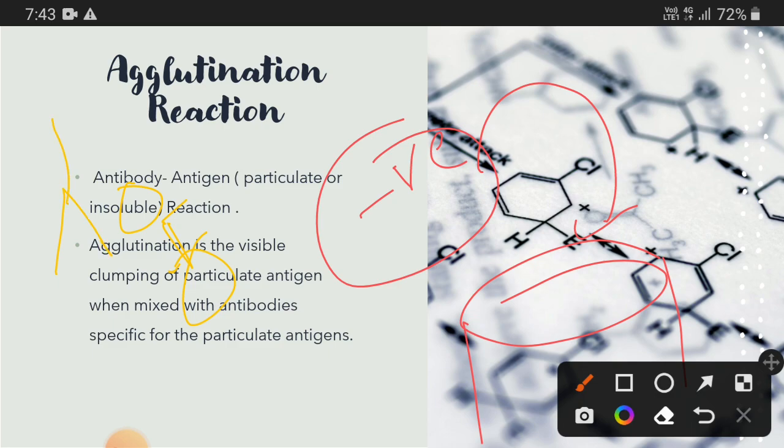These anti-immunoglobulins are specific for the non-agglutinating antibodies that are attached to the specific epitopes on the erythrocyte. Once they detect the non-agglutinating antibodies, they not only detect them but also facilitate agglutination.